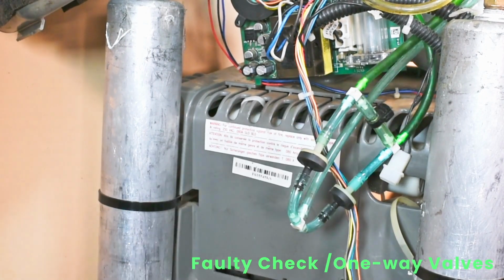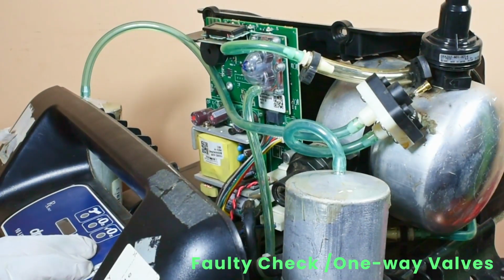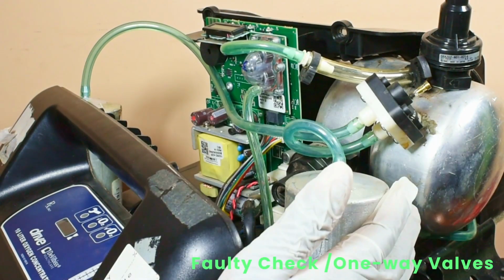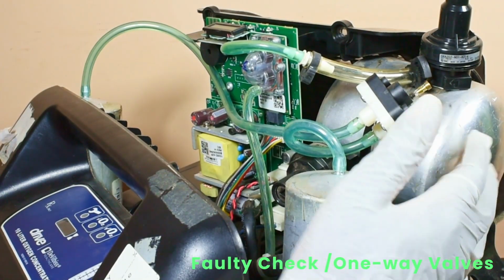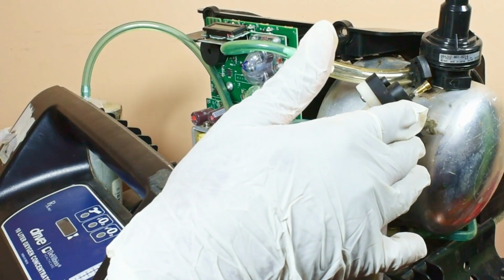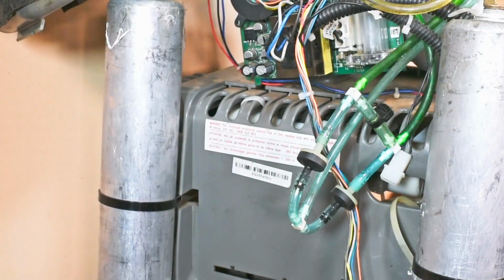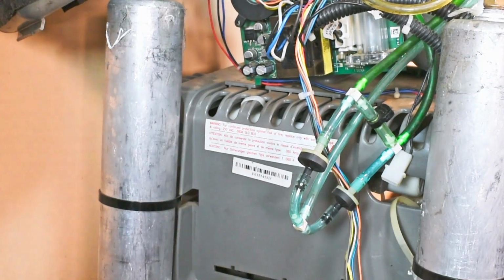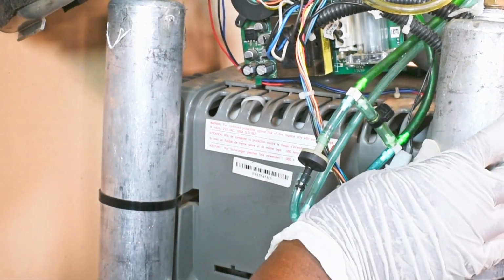In some concentrator models, for example, this DeVilbiss 1025, a manifold is used to combine connections from the sieve beds to the product tank. It contains built-in check valves instead of individual ones, and these valves are responsible for directing the flow of oxygen from the sieve beds to the oxygen tank and not allowing it back into the sieve bed.